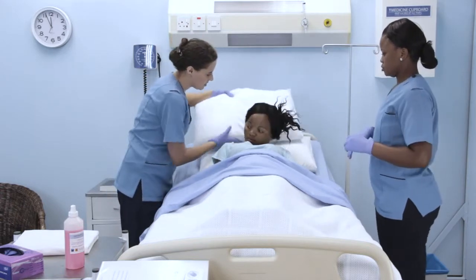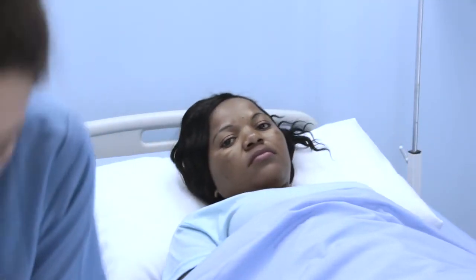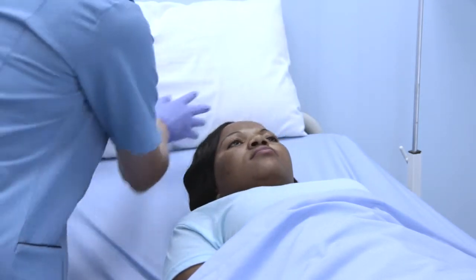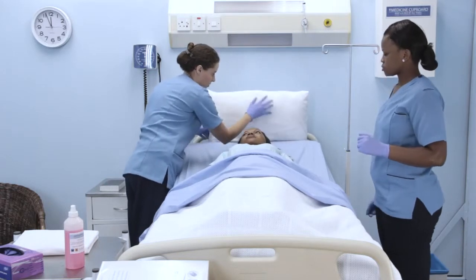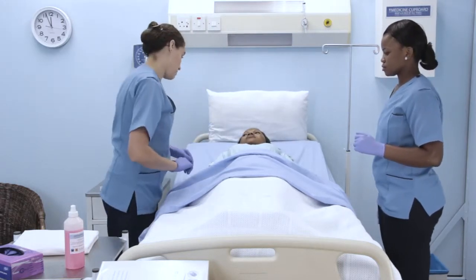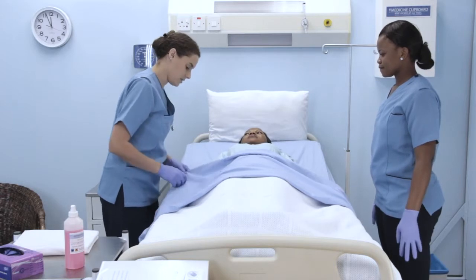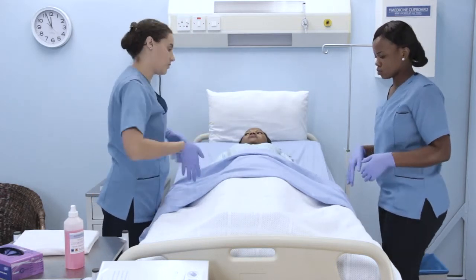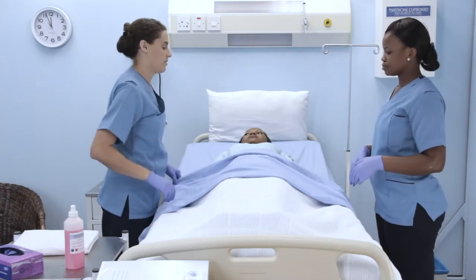Remove all pillows from under and around the patient. Leave one pillow at the head of the bed, leaning upright against the headboard. This will ensure the patient does not injure him or herself when moved. Stand next to the patient in line with the patient's midsection.